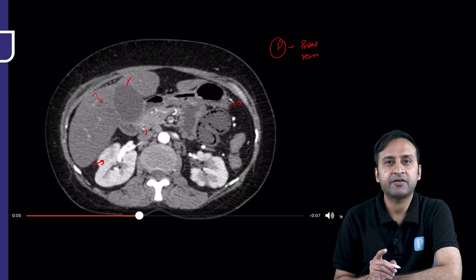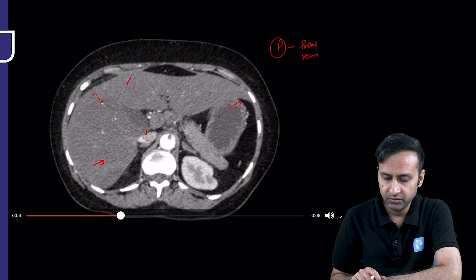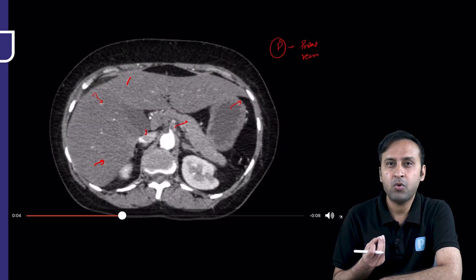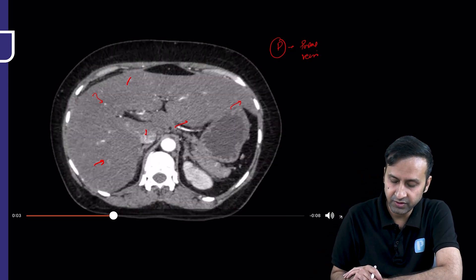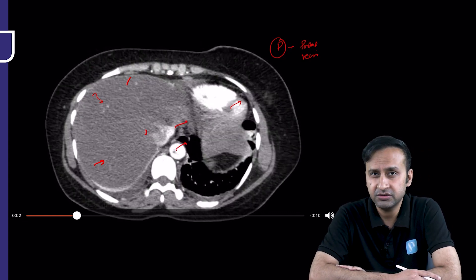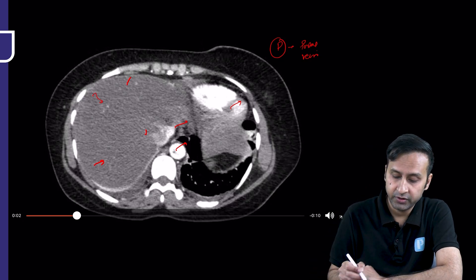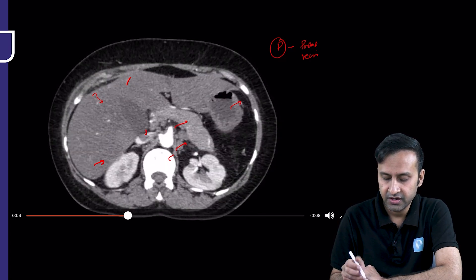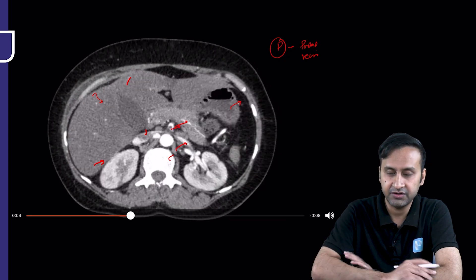Portal venous gas is very troublesome and indicates serious vascular pathology. Look at the celiac artery — you can clearly see there is an embolus lodged in it. I say it's an embolus rather than a thrombus because, if you look carefully, there is a floating embolus visible in the aorta as well. This was a young patient with a history of DVT, and we can see a floating embolus in the aorta along with emboli in both the celiac trunk and the SMA.